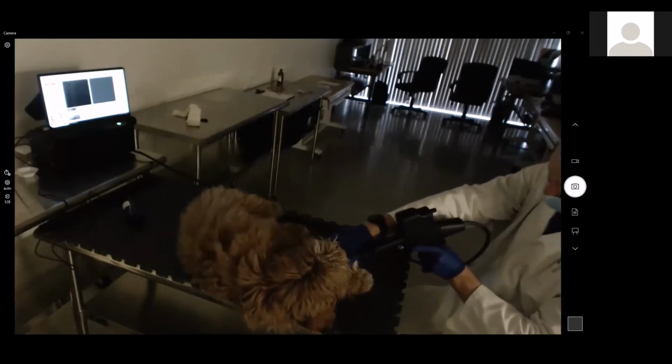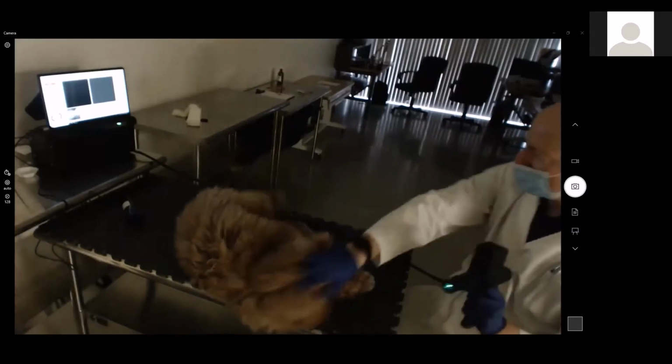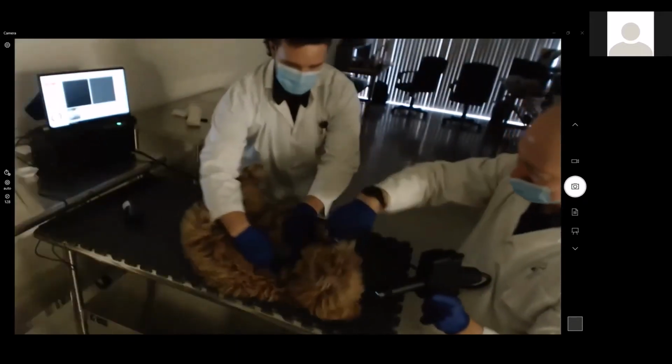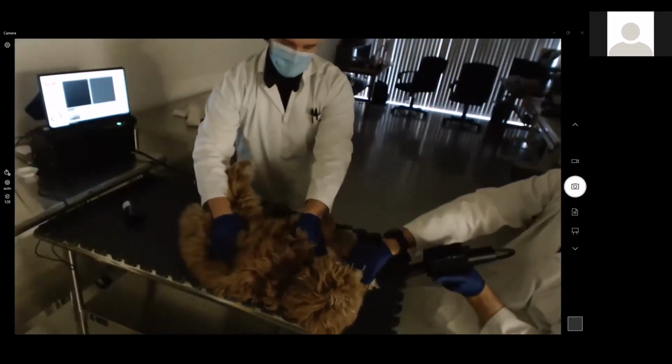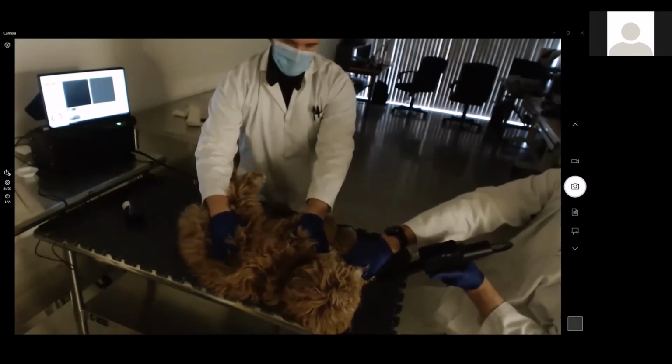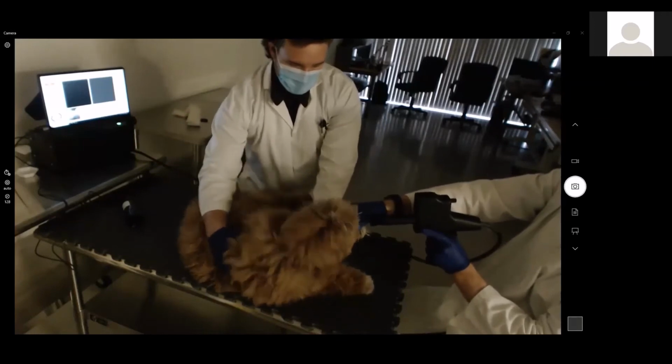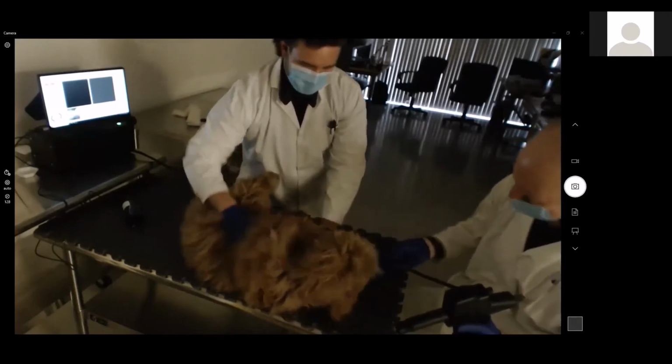I need someone to put hands on him, please. Sorry, I don't want him to roll off the table. I can't hold on to his muzzle. It's okay. Here, I got another one for you.